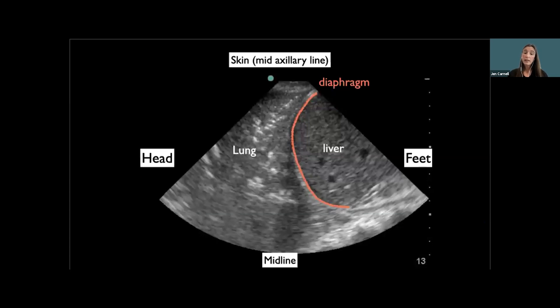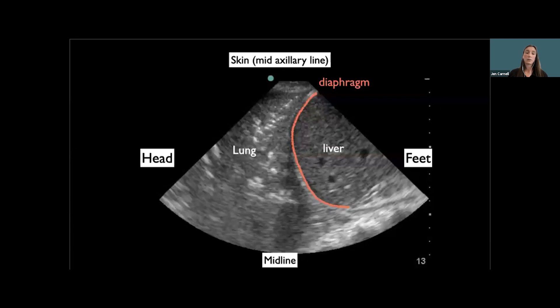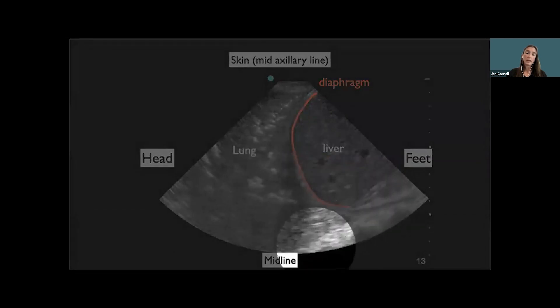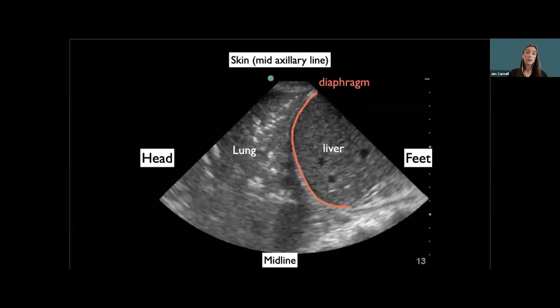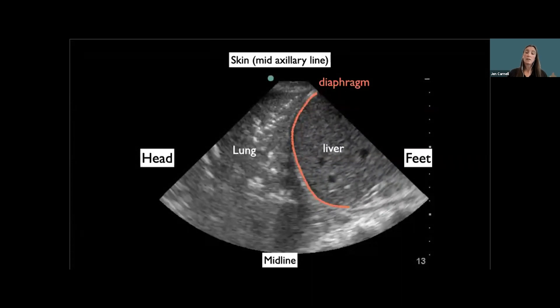I scan the gallbladder — beautiful. I move a little superiorly in the right upper quadrant and get a great view of the liver with the lung just above it. At first glance you might think this is a mirror artifact and it's normal, but two things tell you otherwise. First, all these bright white dots in the lung — these are static air bronchograms, trapped air — which you can see in either pneumonia or atelectasis. Second, the spine sign is present: it's not pleural fluid this time, but pus and fluid in the alveoli conducting sound waves to the spine. Always abnormal.